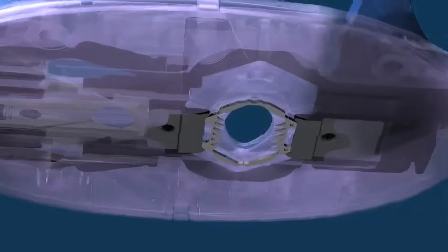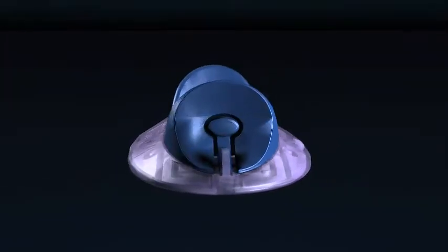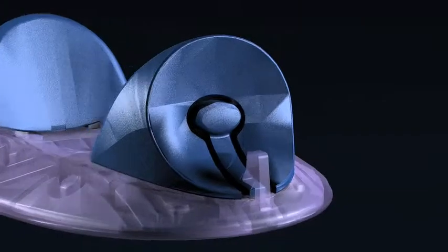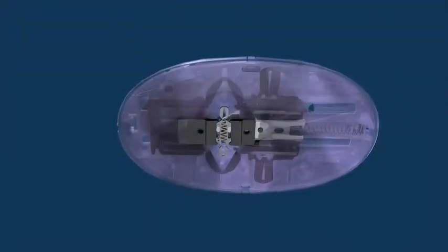With the ExeClip aperture positioned over the lesion, the skin hook elevates the lesion above the plane of the device. The safety latch depresses, the thumb grip slides forward, and the driver compresses.